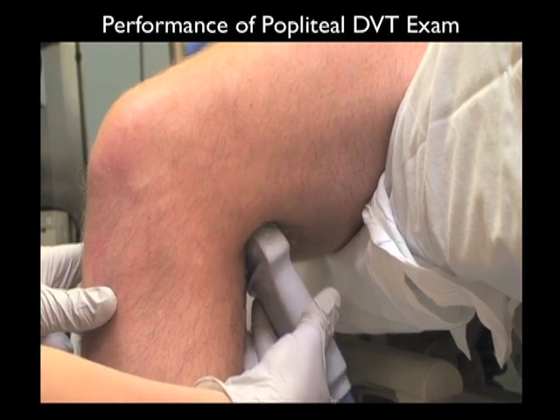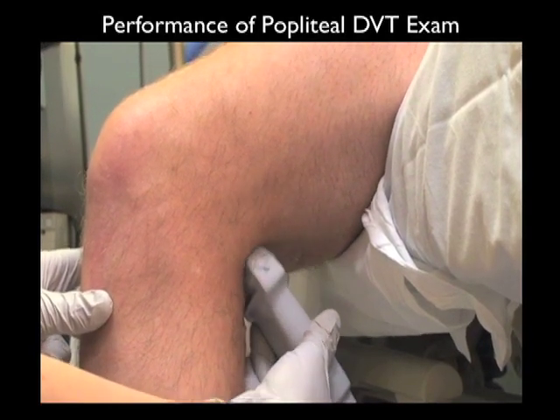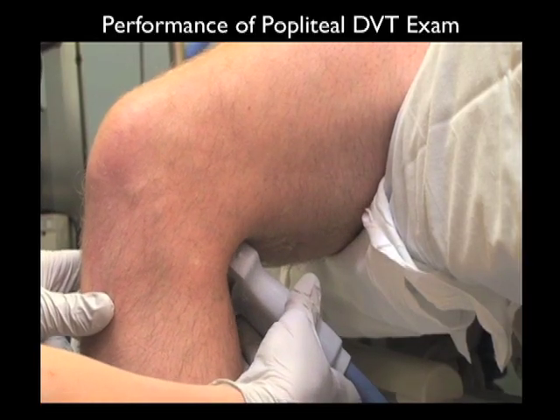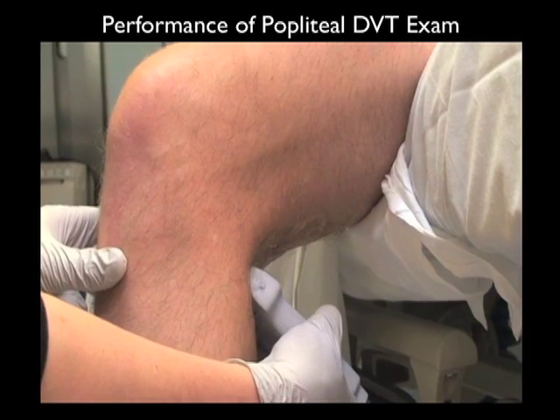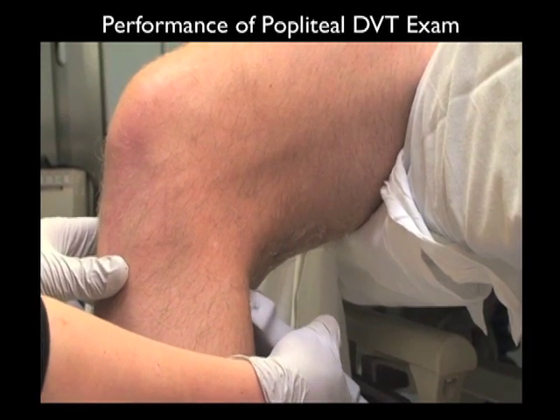probe posteriorly. So again, we'll start high within that popliteal fossa, compressing sequentially all the way through the levels of the popliteal artery and vein, down inferior there, all the way down to trifurcation.